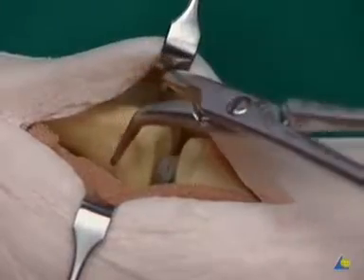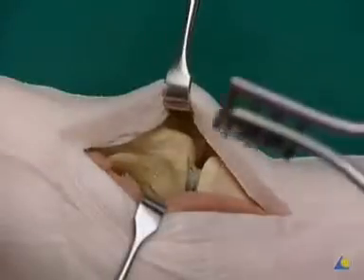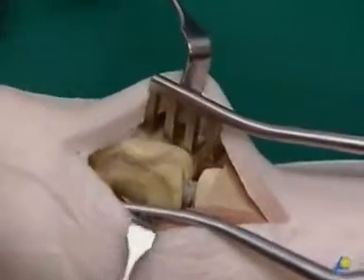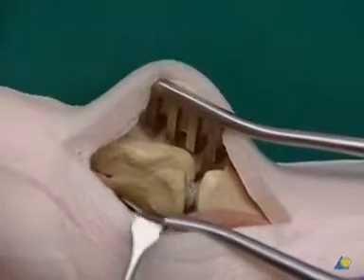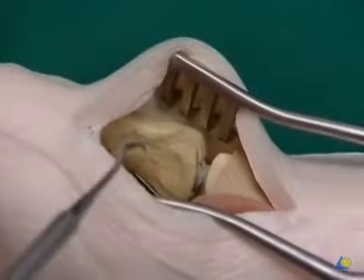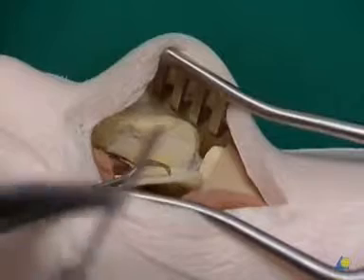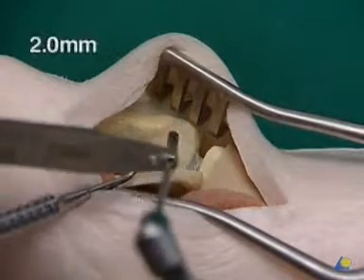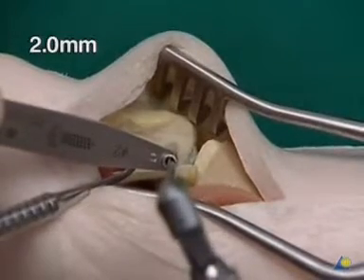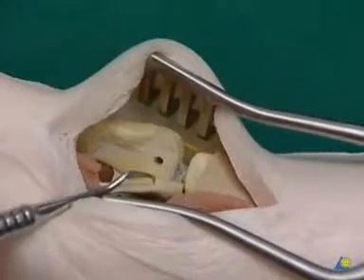For the planned inside-out method, the small reduction forceps is removed. After a wound spreader has been applied, the Bennett's fragment is folded over with a sharp hook. The first gliding hole is now drilled with a 2 mm drill bit, beginning at the fracture surface and aiming in the dorsal radial direction at a 90 degree angle to the fracture surface.